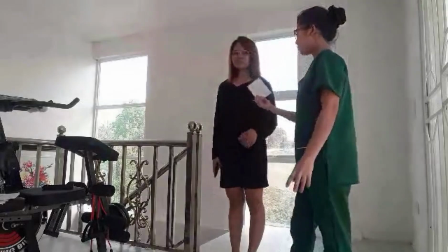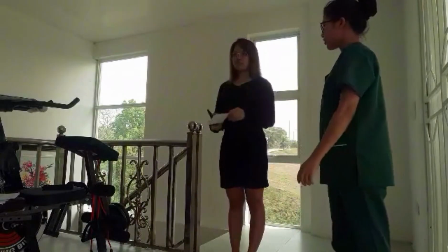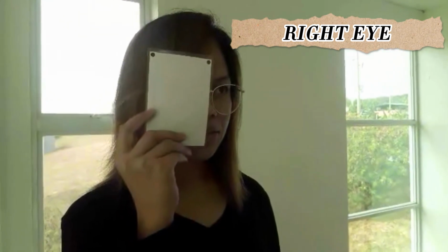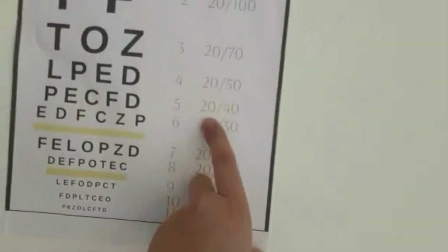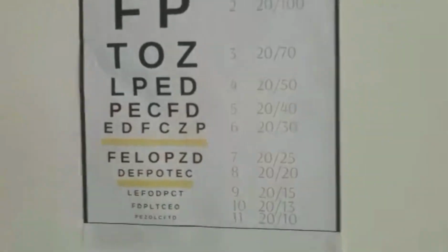Instruct the patient to cover one eye with an opaque card and read the Snellen chart. E F P T O Z L P E D P E C F D. So the patient can only read until here, 20/40 vision in the left eye.